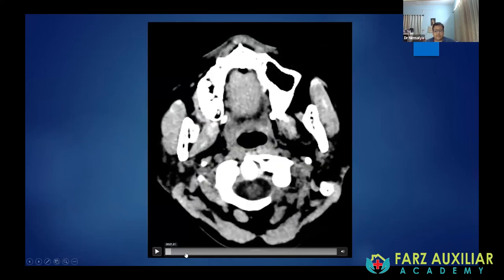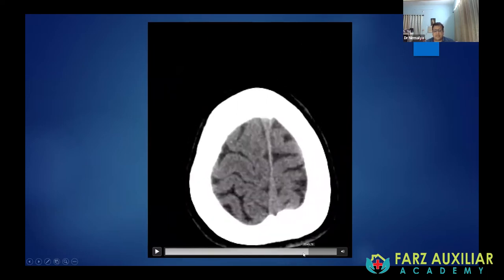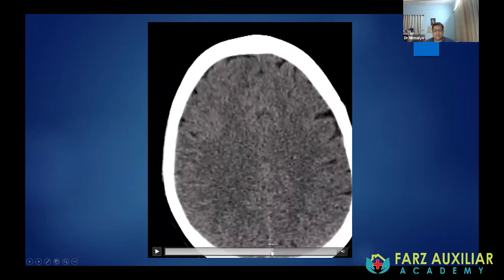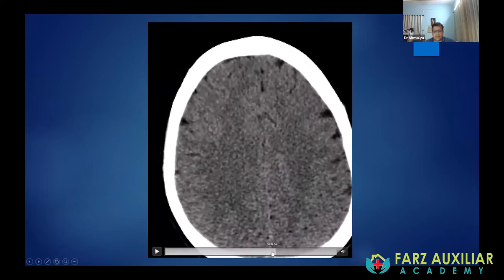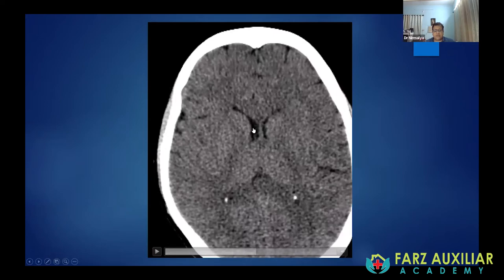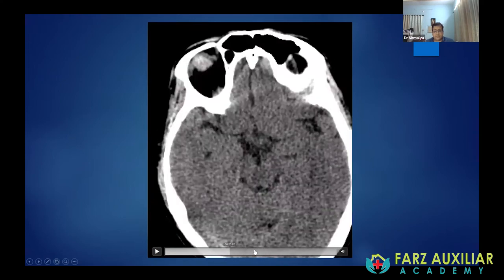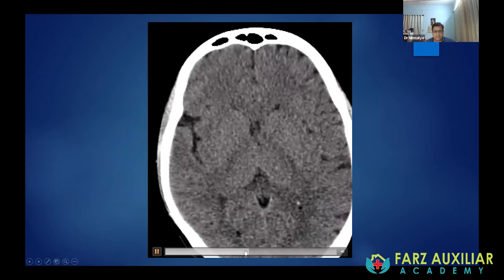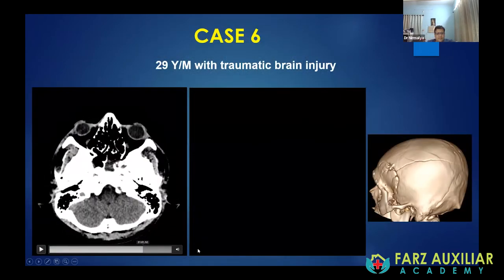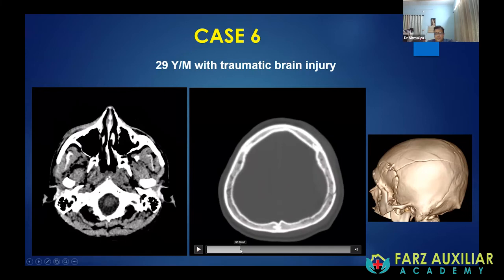This is a normal CT brain, coming down slowly from the top cut. Very high regions are generally the parietal lobe, then the frontal lobe begins. After that is the centrum semiovale and the periventricular white matter. As we come further down, we can see the putamen, the caudate nucleus, the bilateral thalami, and the temporal lobes. We should also look at the bone window to check whether there is any fracture.